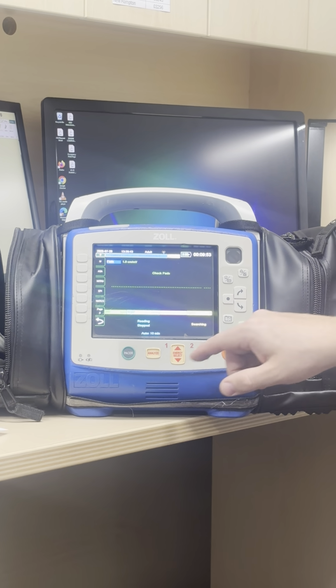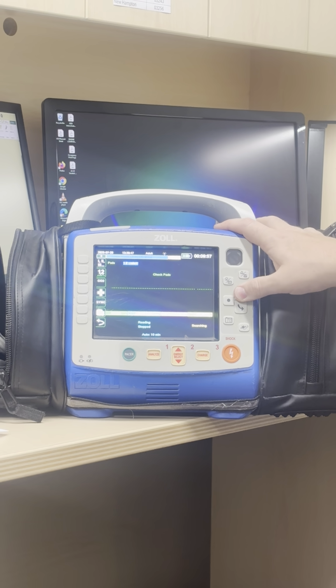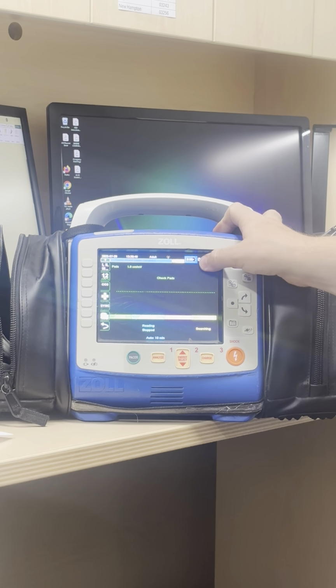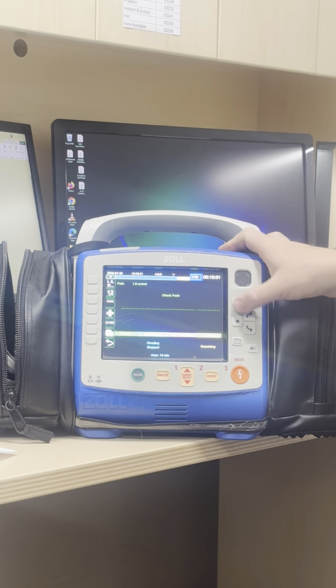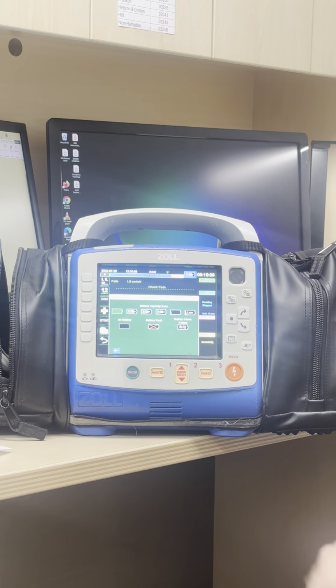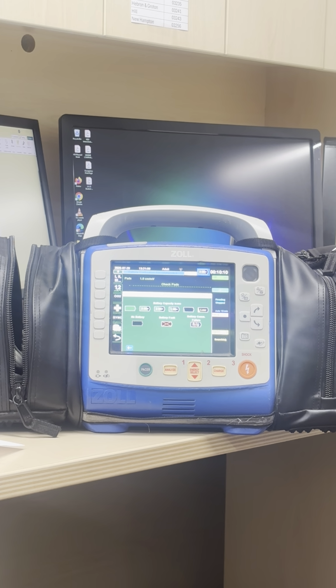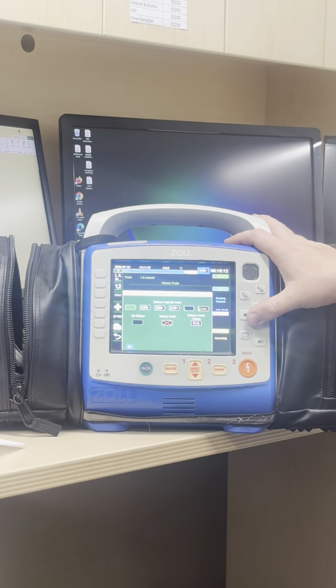Next, we're going to check the battery status and when to know when it's time for reconditioning. If you cycle around to the battery, you can click on the indicator here. Currently, we have 3+ hours on our battery life. It shows you the different symbols. And when it gets to fault or communication failure, we know that we need to put it on the reconditioner.